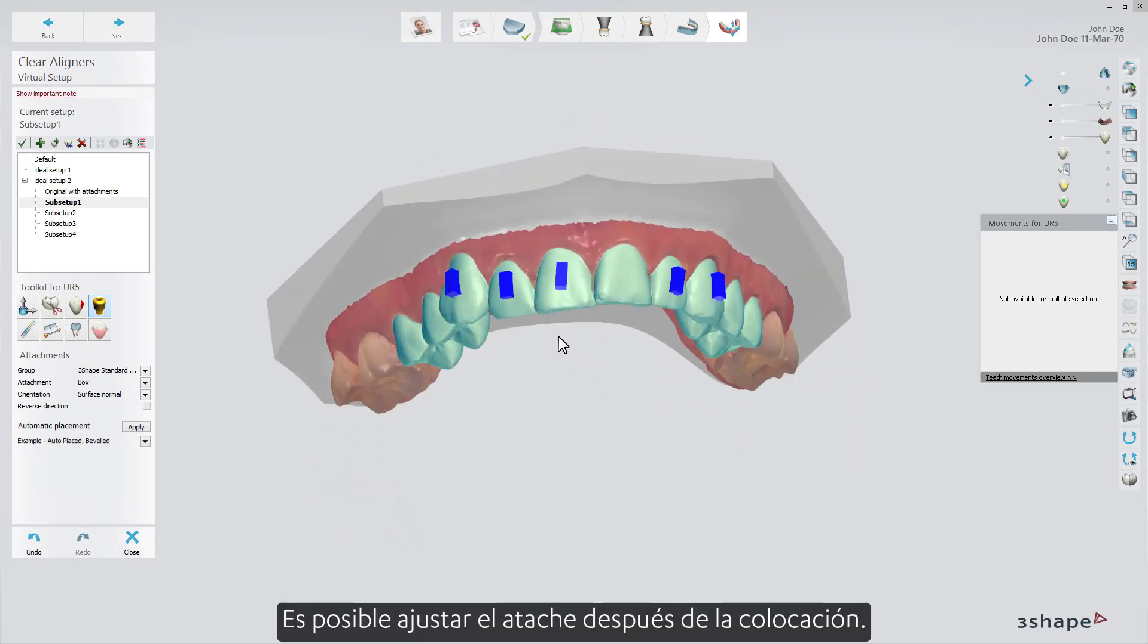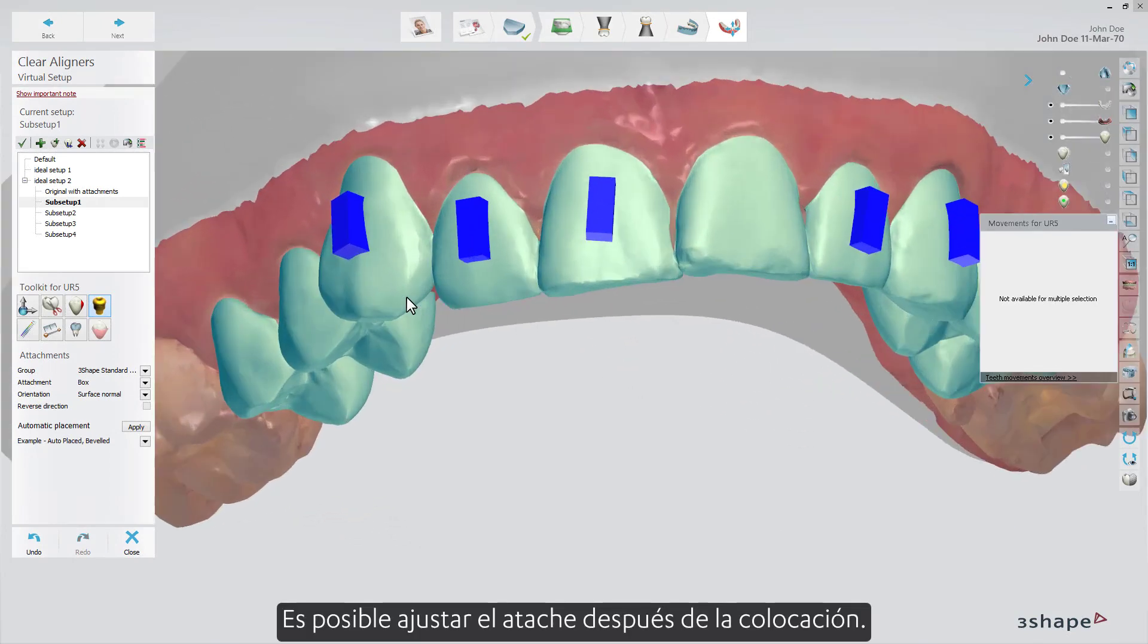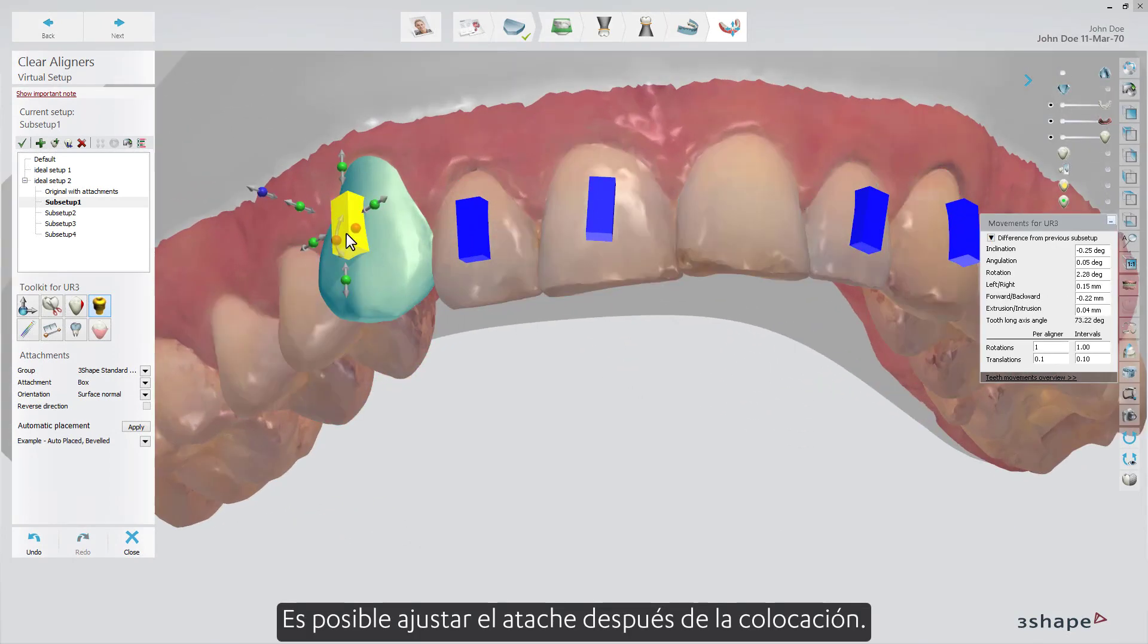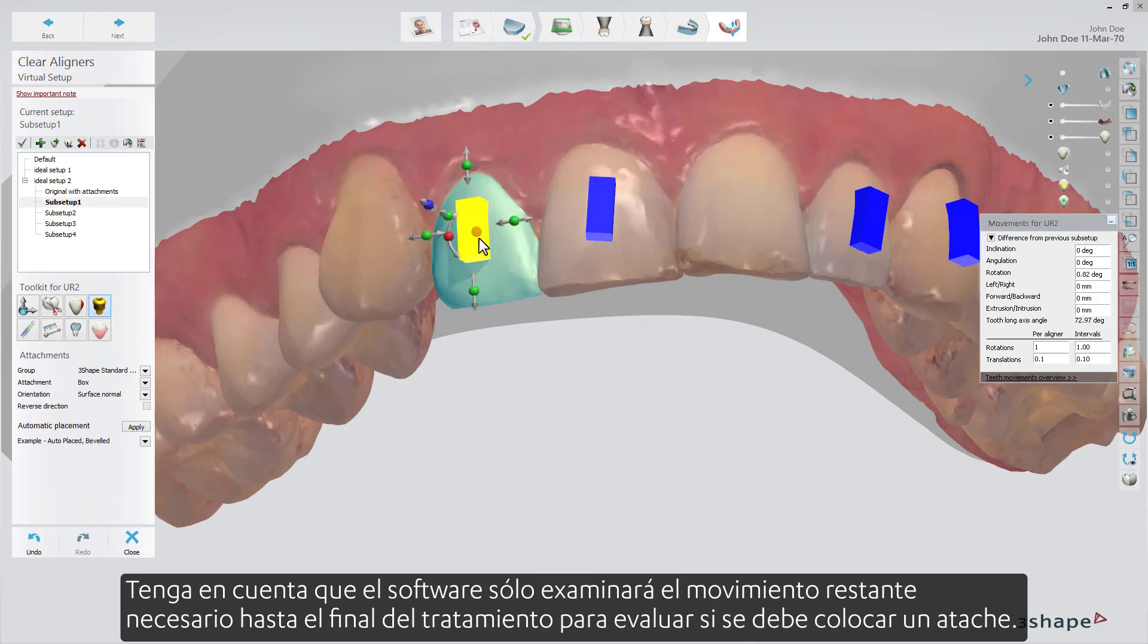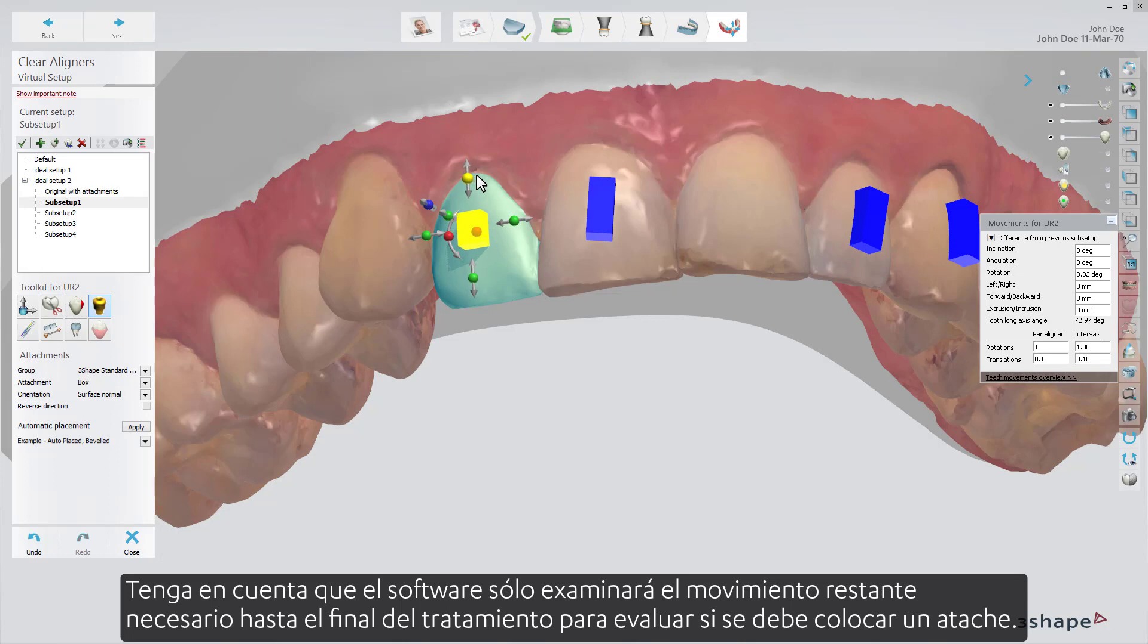It is possible to adjust the attachment after the placement. Please be aware that the software will only look at the remaining movement needed till the end of the treatment to evaluate if an attachment should be placed.